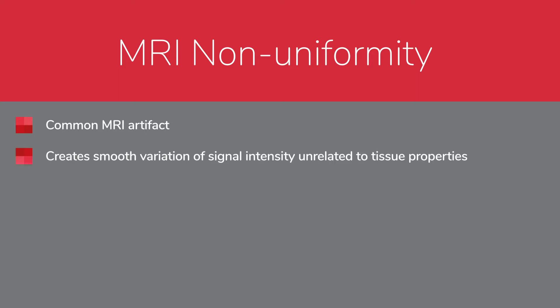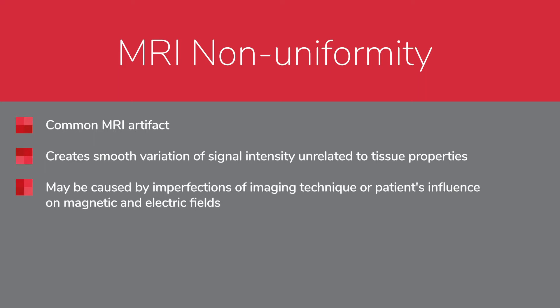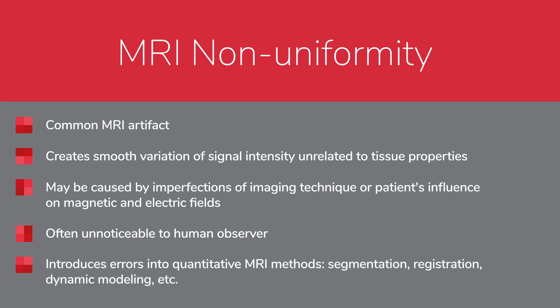Non-uniformity of image intensity is a common MRI artifact. It creates a smooth variation of signal intensity across the image that is unrelated to tissue properties. This artifact may be caused by imperfections of the imaging technique or the patient's influence on the magnetic and electric fields. Non-uniformity is often unnoticeable to a human observer, but it may introduce errors into quantitative MRI methods such as segmentation, registration, and dynamic modeling. To minimize these errors, it is often helpful to remove the non-uniformity artifact before analyzing images.